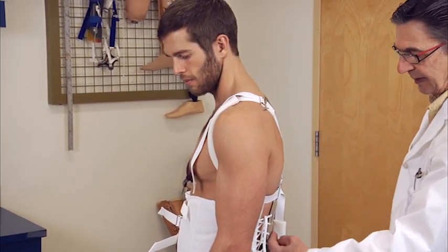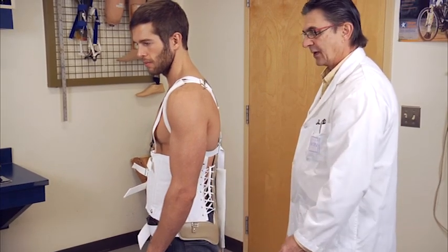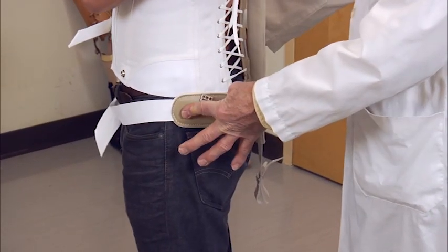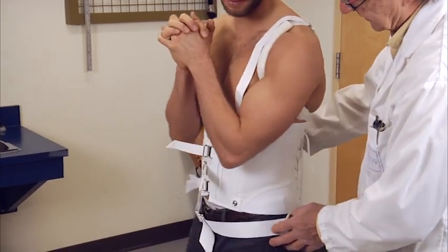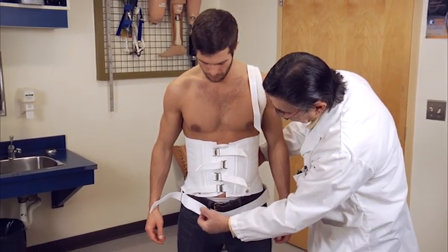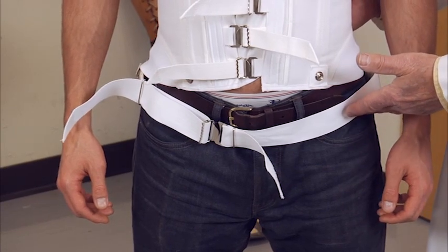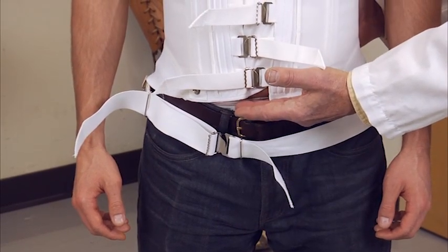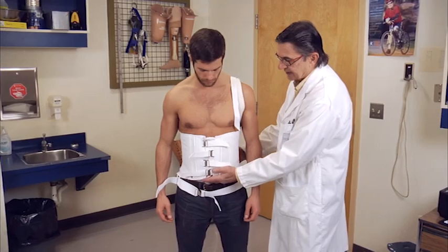Again, we have the gapping at the back. This can be bent if you find the gap is too much, but be careful — don't forget they're going to have dressings on. The primary things are: you want the band to be between the trochanter and the iliac crest. Because we don't have any lateral stays, that's what you go by. This pelvic belt is what secures the brace onto the pelvis — it's just on a slider, and you snug it up fairly snug. You don't have to worry about the abdomen; you're getting onto the pelvis with this. You want it as low as you can on the abdomen so that we're pulling up under the tummy, particularly if the patient has a pendulous abdomen.